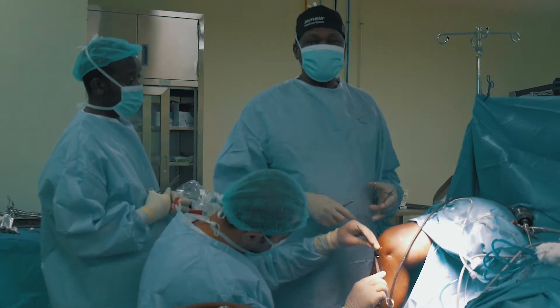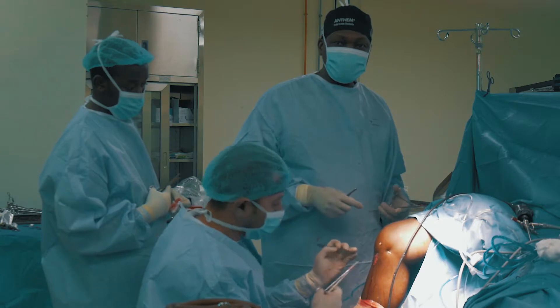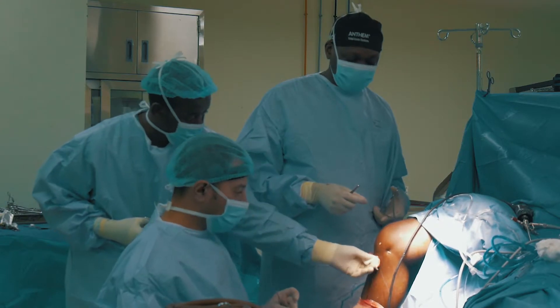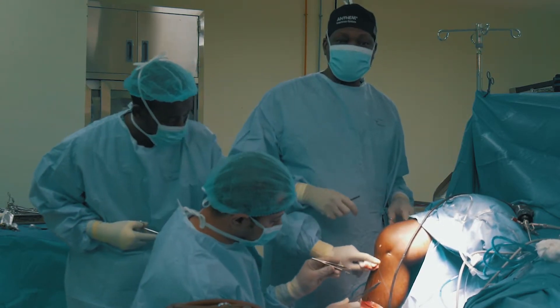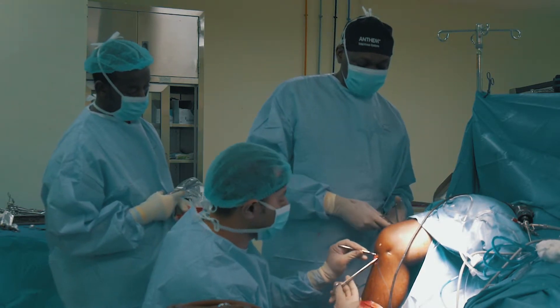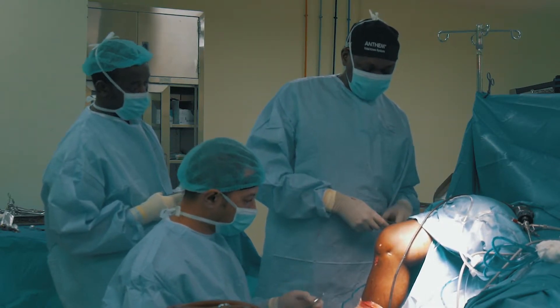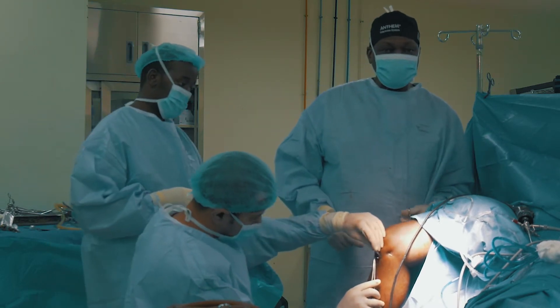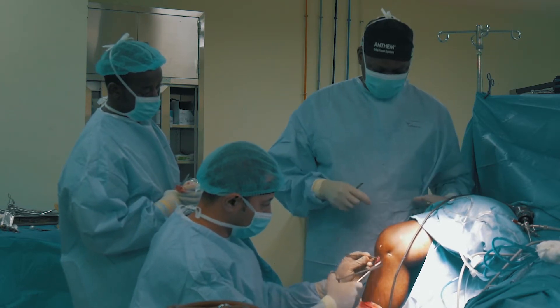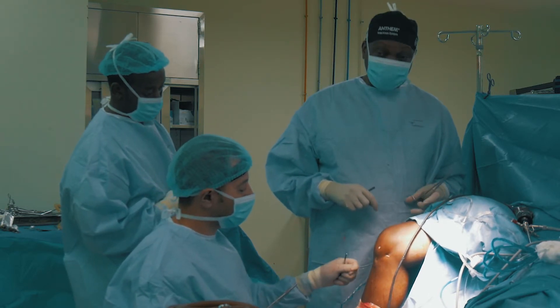I'm happy this has been a successful surgery, comprising of meniscus repair. This patient had a medial meniscus tear which we have successfully repaired with a technique we call inside-out meniscus repair. We followed this with the reconstruction of the ACL — the anterior cruciate ligament. We have used a graft from a tendon called the semi-tendinosus tendon.